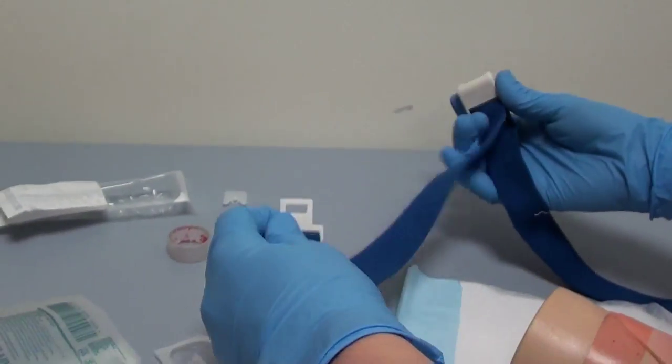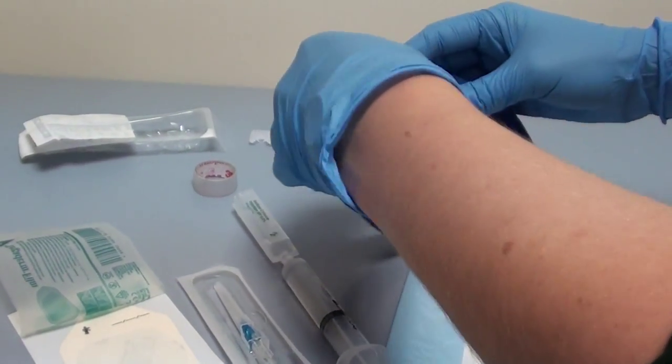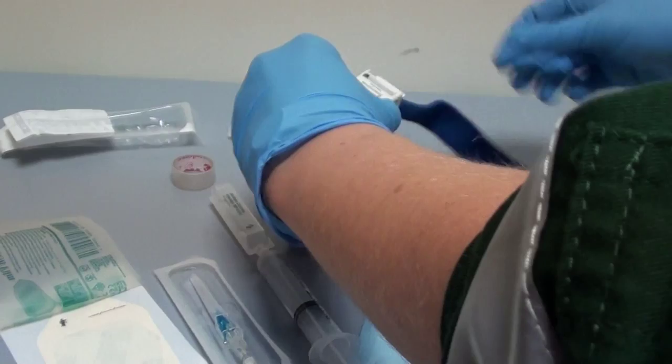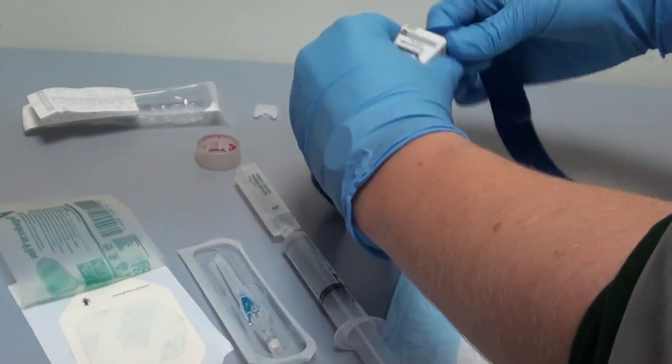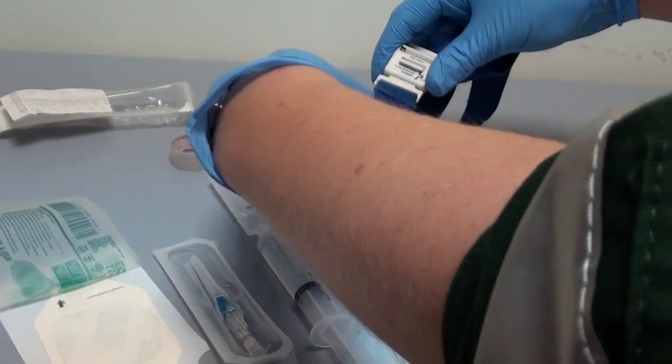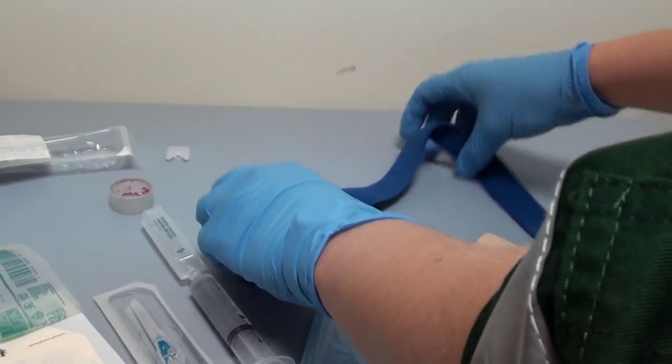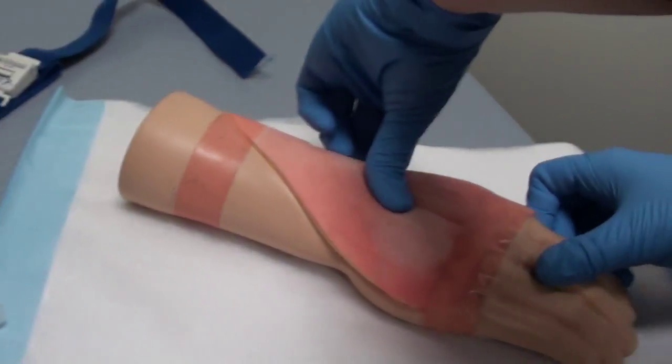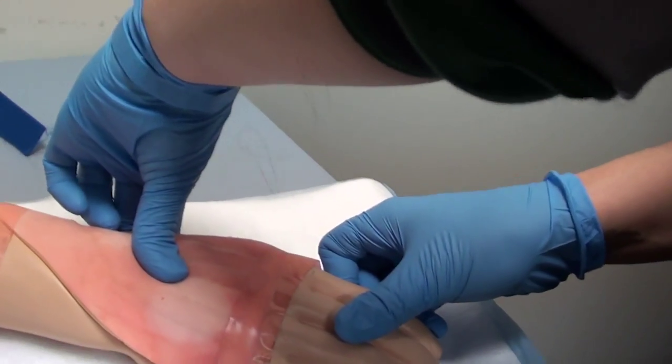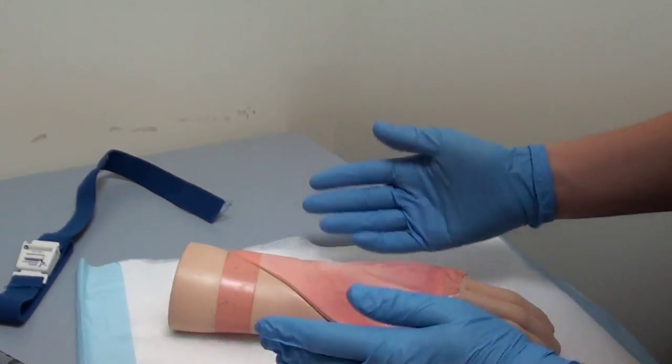Is it alright if I pop this tourniquet on? Just put that on further up the arm, assuming the arm extends up here. I'll just tighten it so that a couple of fingers can just go under. So that's done up there. Just going to feel a weak radial pulse there.